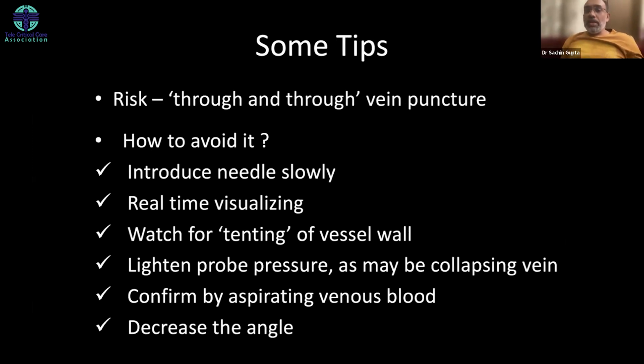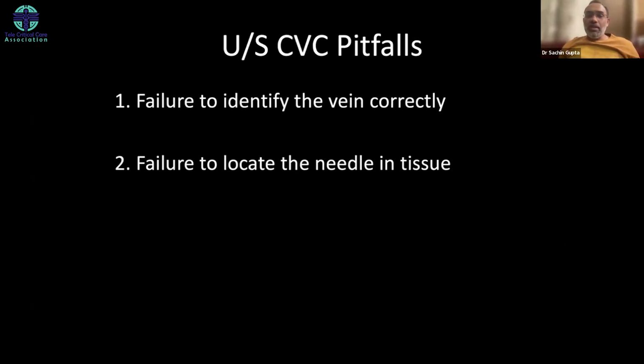Risk is through and through venous puncture. So avoid that: introduce the needle slowly, always have real-time visualization, and watch for tenting of the vessel wall.